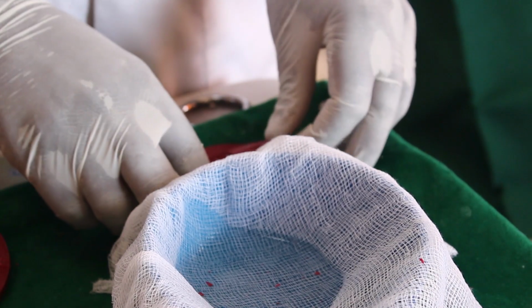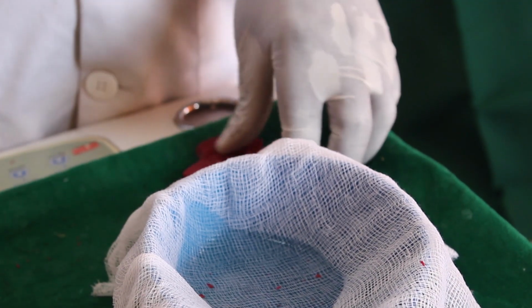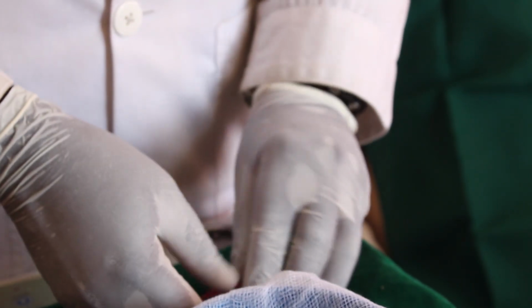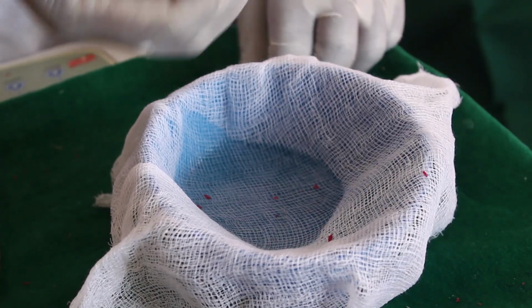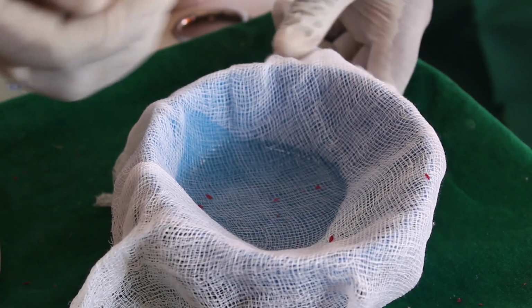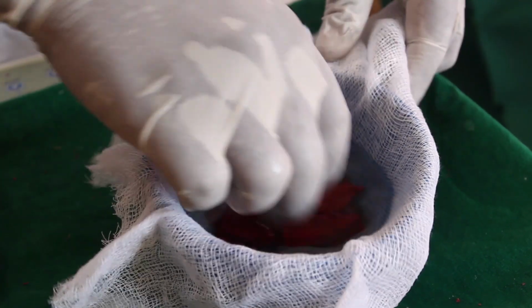So to make the impression compound ready for making the impression, we have to break the impression compound into pieces for easy softening of the material, and you have to put this impression compound in gauze to avoid sticking of the impression compound to the bowl. And make sure that the hot water is a minimum of 140 degrees Fahrenheit.